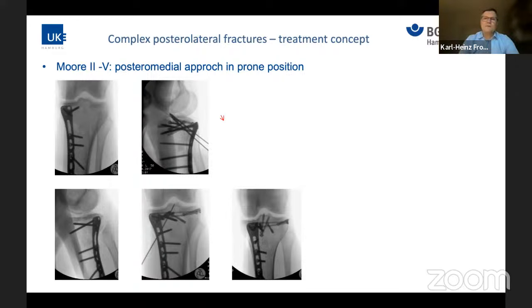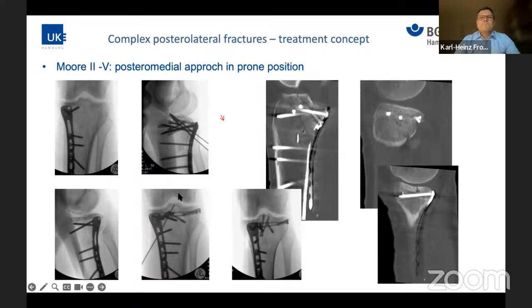And what we also did is what we call the Robin Hood shot for the bony ACL avulsion. So we usually go in with a tibial ACL aiming guide, from posterior between ACL and PCL. We go through from posterior to anterior, hook in the bony fragment, reduce the fragment from posterior, and then through the guide, we drill in two K wires for cannulated screws, and we fix it with a drill guide placed in situ. Then we fix it retrograde with two screws. This was performed in this case, as you see here.